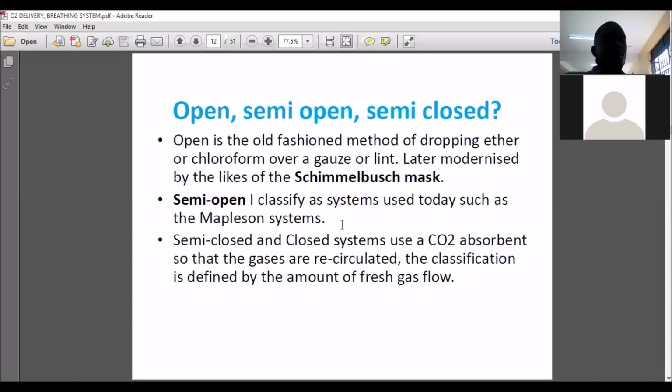I hope these ones are also getting it. Okay, what I mean, in this perspective, to enlighten you more: when I've intubated you, you're only getting oxygen from my oxygen tank, you're getting me, and then your carbon dioxide is going back. There you're semi-closed.